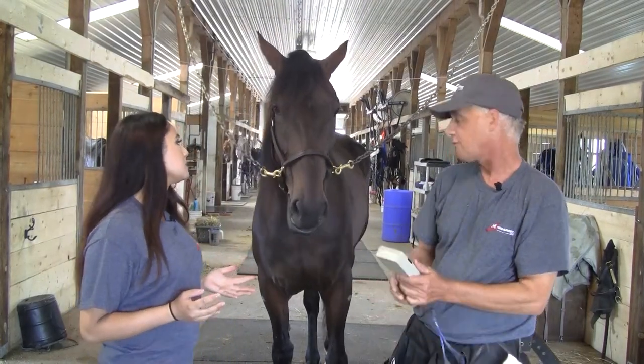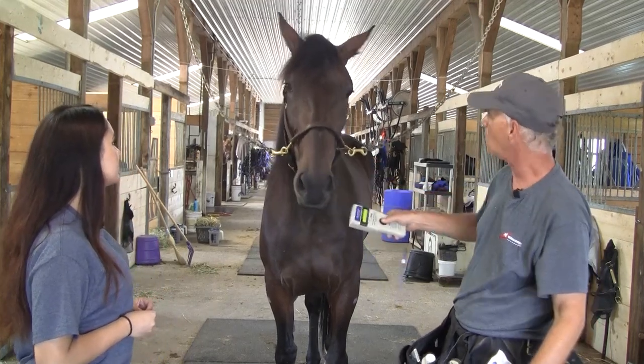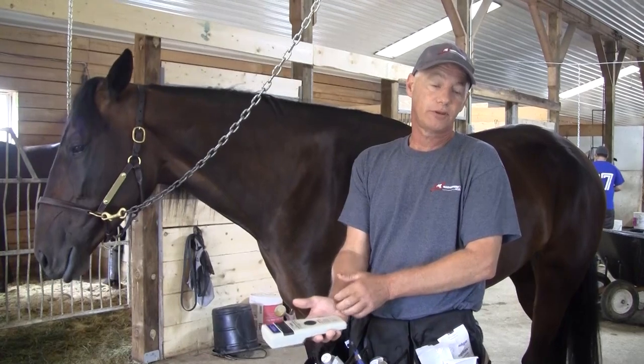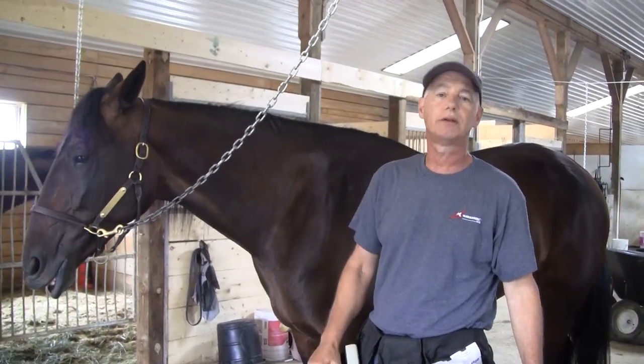We start out always by checking first to make sure there isn't a chip in the horse previously, by waving the scanner over their nose and their neck. I'm satisfied there isn't a previous chip in the horse, so we can now move forward to the next steps, which are clipping, swabbing, and inserting the chip.